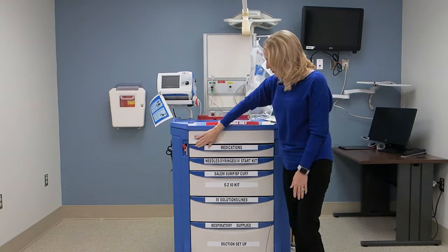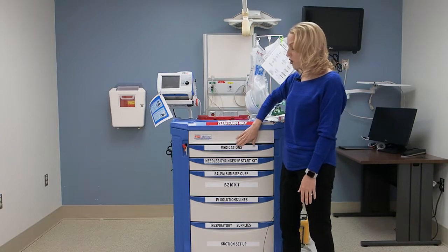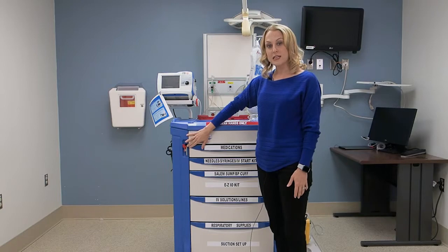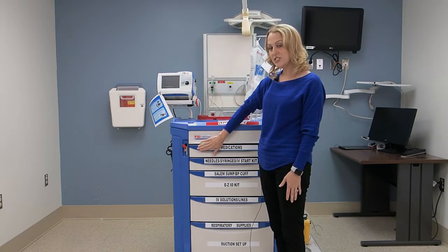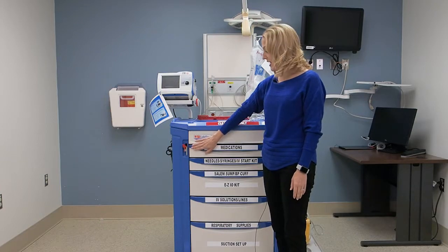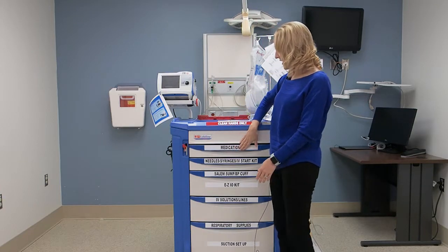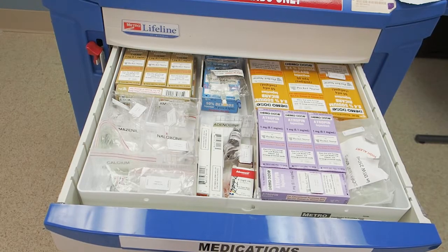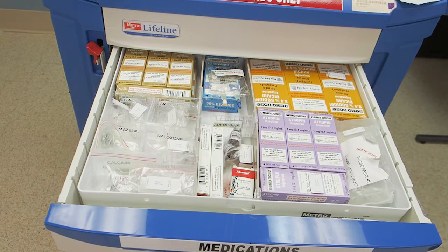And then we're going to look first at the medication drawer. On a cart that's out on the unit, you're going to see there is going to be a label, and it's going to have an expiration date, and that date's going to be for the drug that's going to expire next. So that's something you always want to be checking. And then in this drawer is going to be all of your medications that you would use for a code blue event. Easy to access, easy to get.